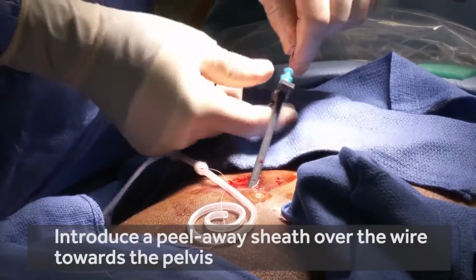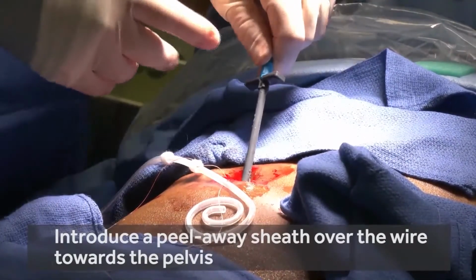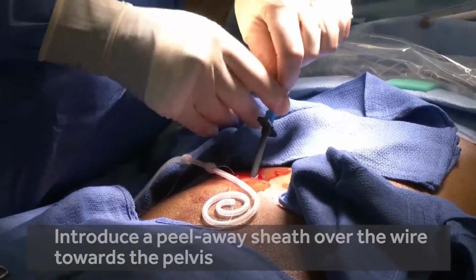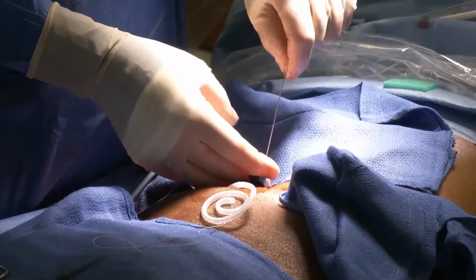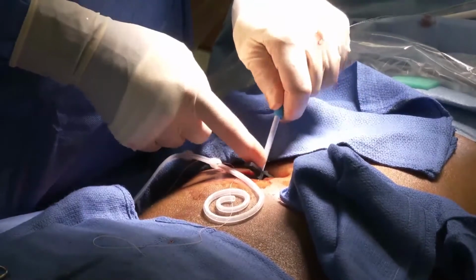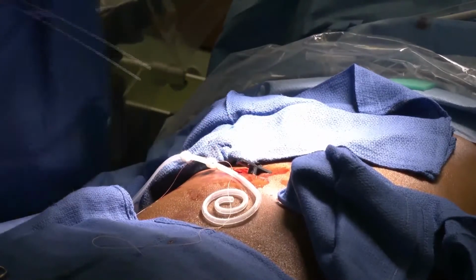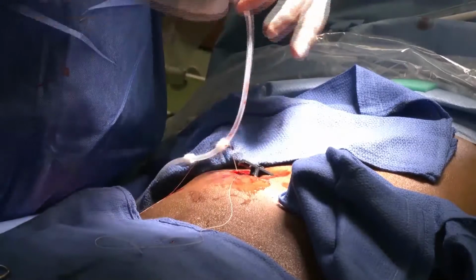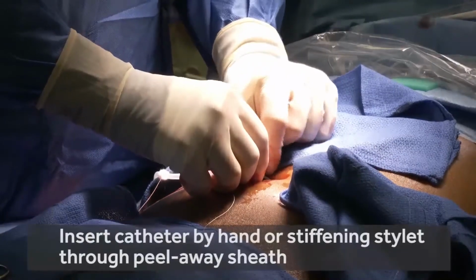You can see me moving the wire back and forth. This confirms that the wire hasn't been kinked. If you push the dilator and you cannot move the wire, you should check under fluoro to make sure you have not kinked the guide wire. Remove the inner stylet and the guide wire together. And we'll advance the catheter through the peel-away sheath.